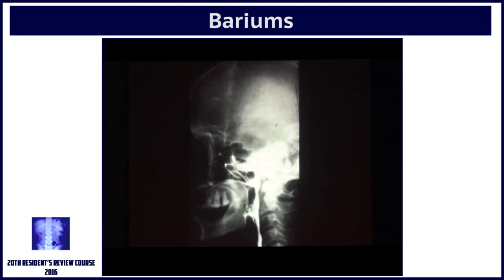Once there is nasopharyngeal reflux of contrast, you know that there is something wrong. Imagine somebody putting a scope down here, and he or she will find nothing and say that the endoscopy is normal. So this is one dynamic example of palatal palsy where there is reflux here. This is just the tip of the iceberg. When you see something like this, the patient has pharyngeal palsy.